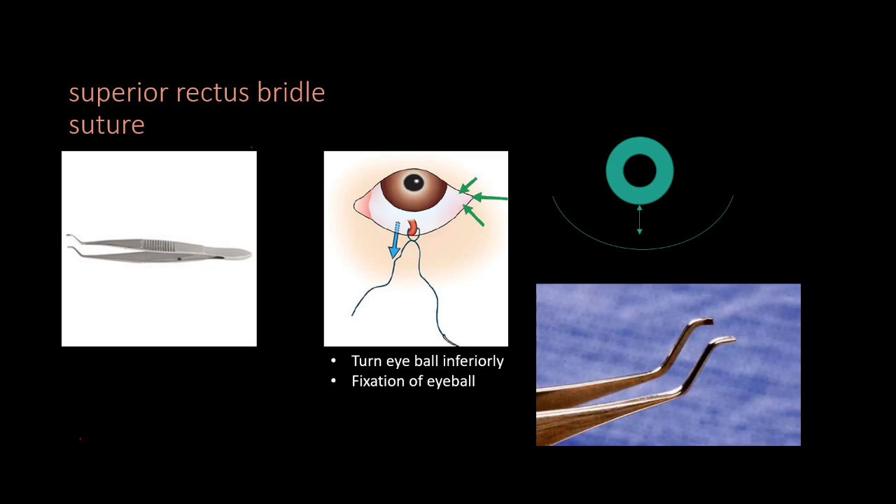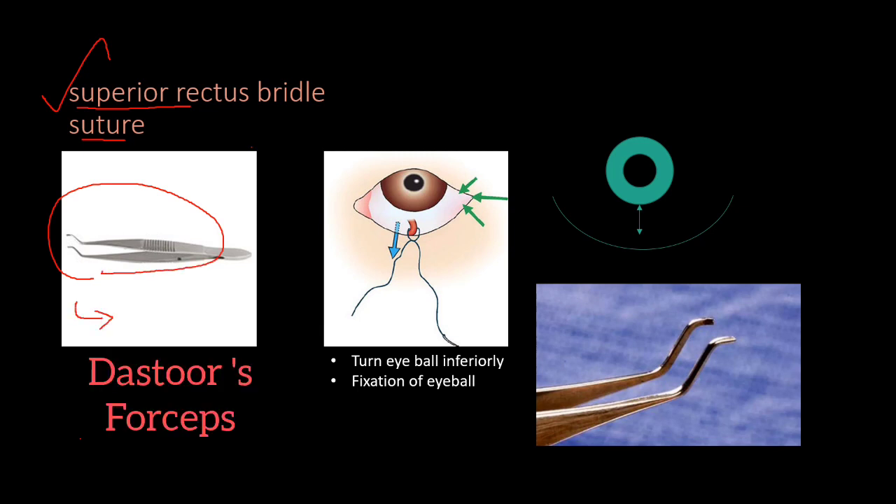After performing the basic steps, we will move to the major steps. Superior rectus bridle suture is the most important step here. We will use the superior rectus holding forceps, also called the Dastoor's forceps. It is a double-bend forceps used to hold the superior rectus tendon.